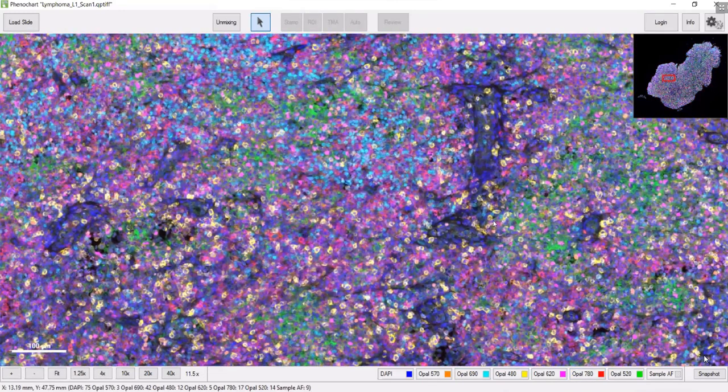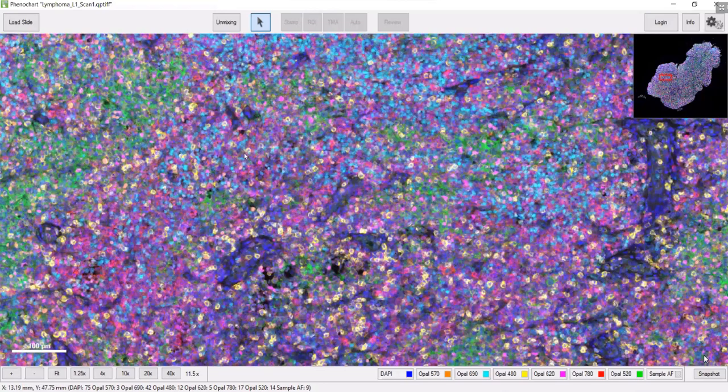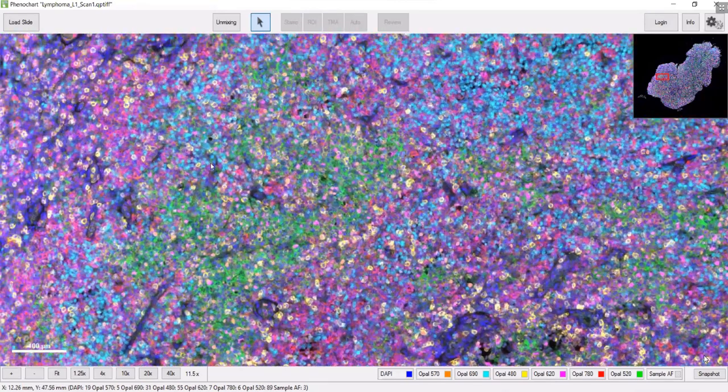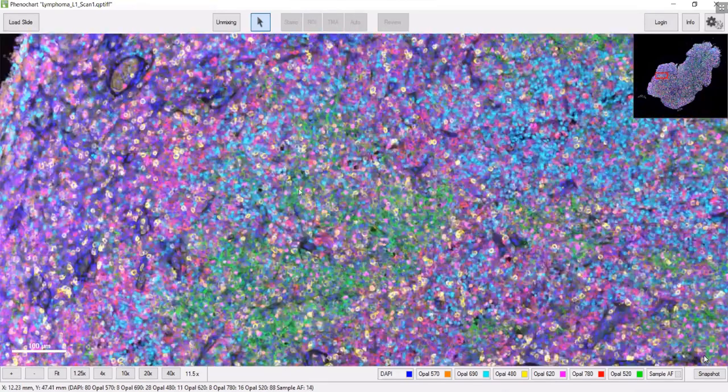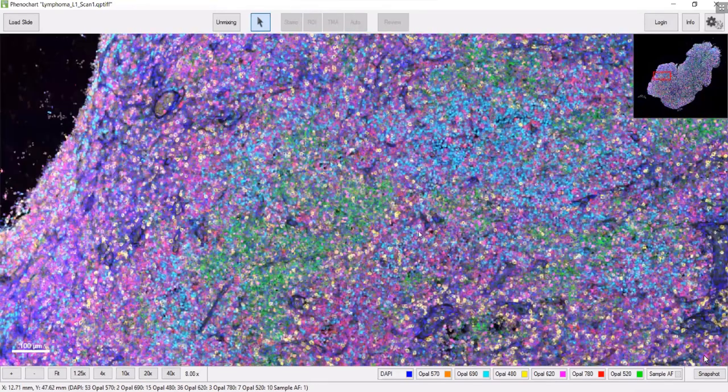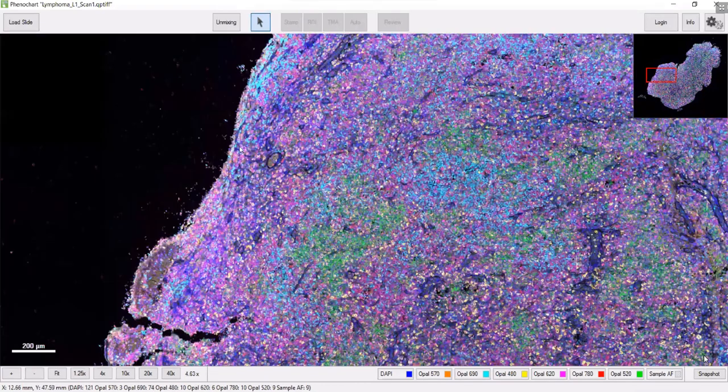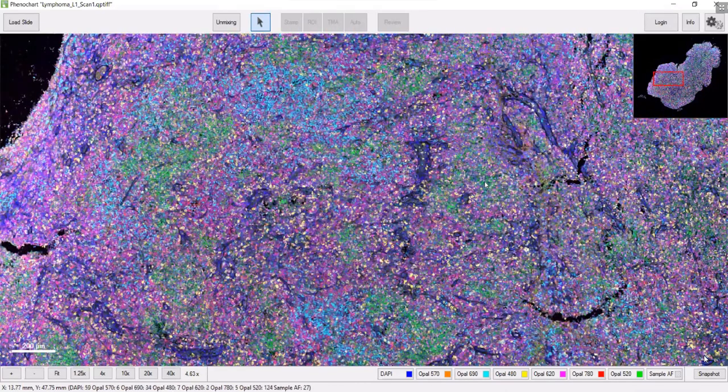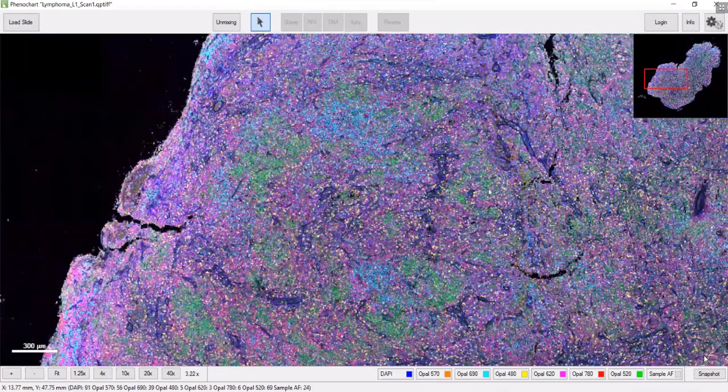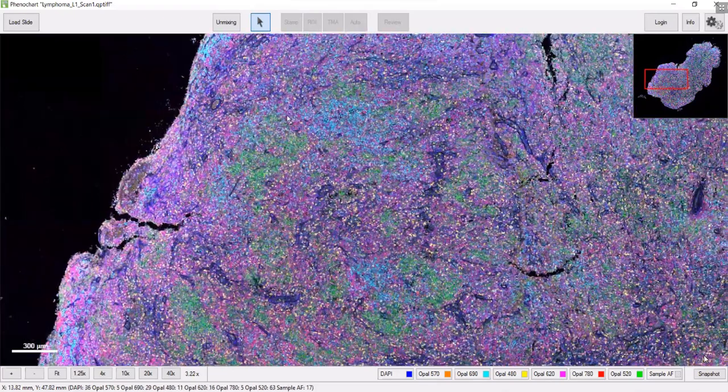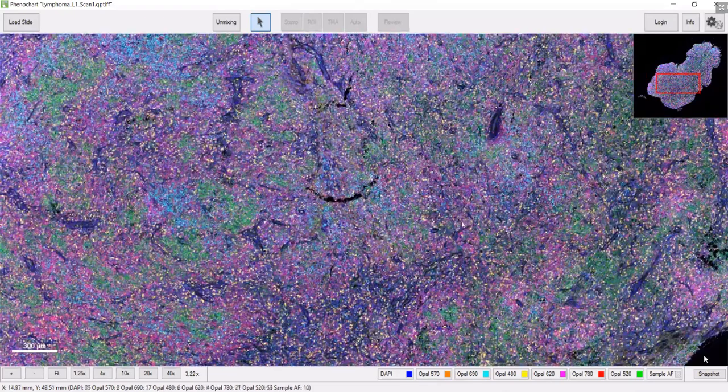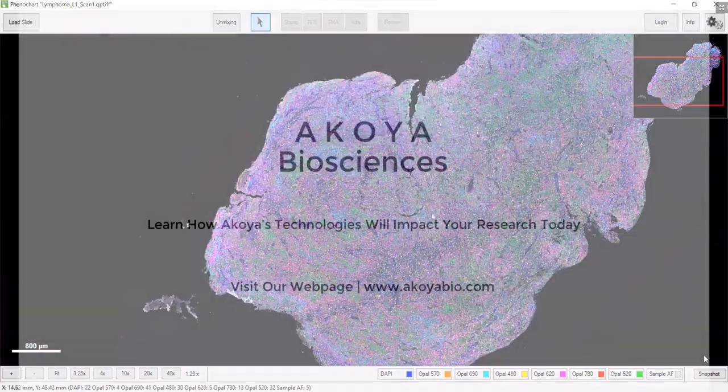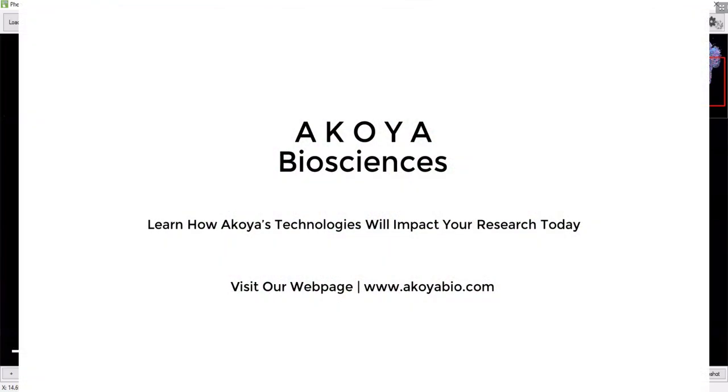This is a very dense field of cells. There's actually quite a bit of heterogeneity across the sample in terms of who's right next to who. There's an awful lot of biology going on in this one sample.